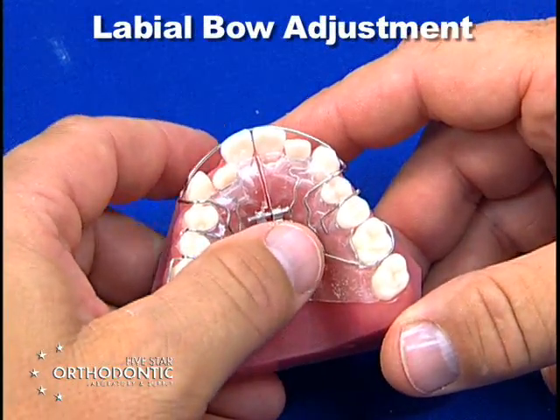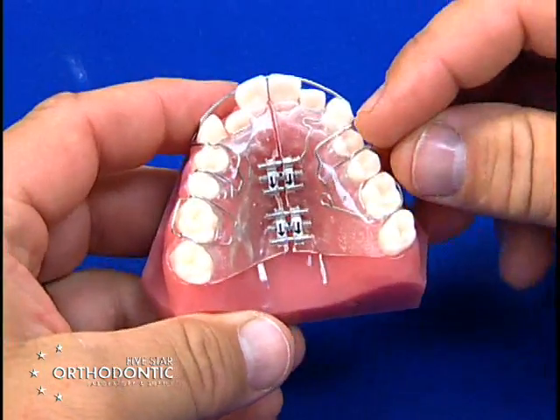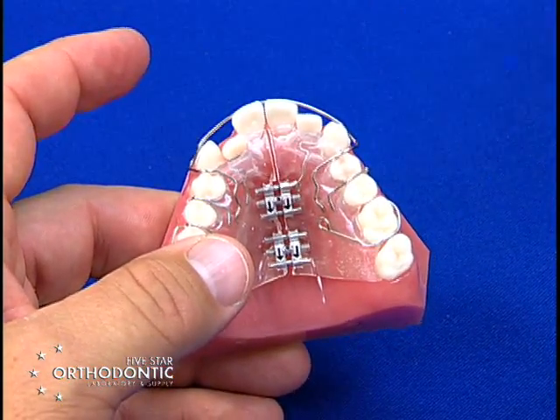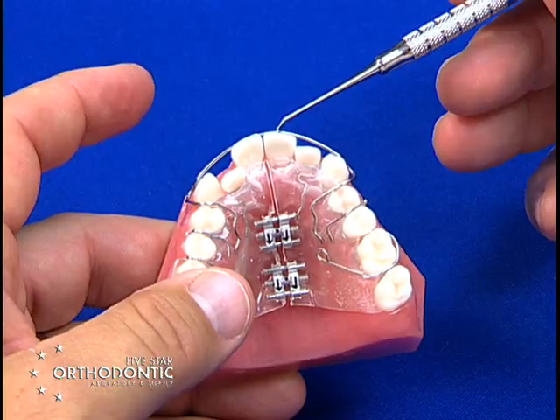Labial bow adjustment. Anytime you have an appliance Schwarz plate and you start to activate transversely, the labial bow will retract — and that's okay if you want the labial bow to retract. If you have protrusive incisors, such as the appliance you see here, you can just allow it to retract naturally.